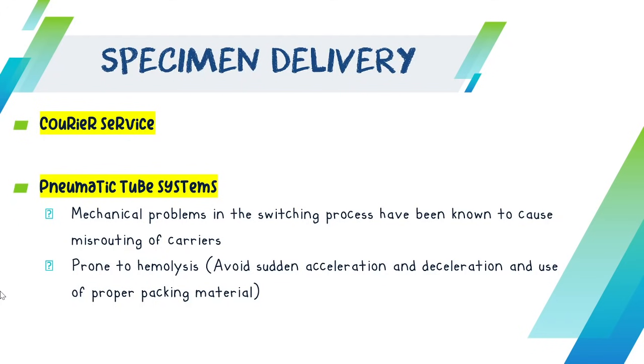And actually, this is one common study, looking at what the effect is on samples if they are delivered through pneumatic tube systems. Actually, you can study that. So this is just a short video about what a pneumatic tube system looks like. In case you have not seen one, or if you have already seen one, then you can just skip this video.